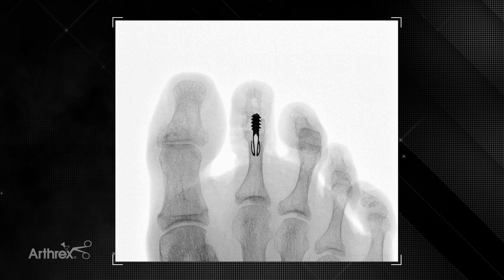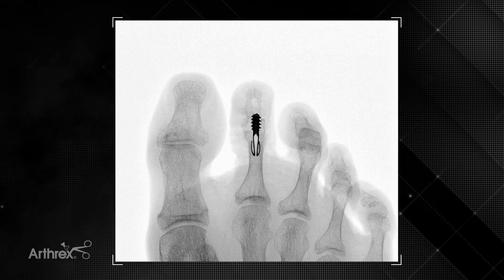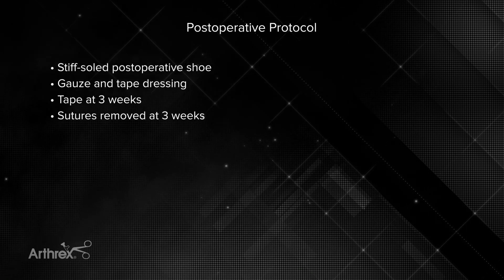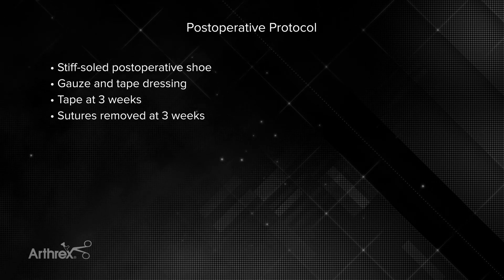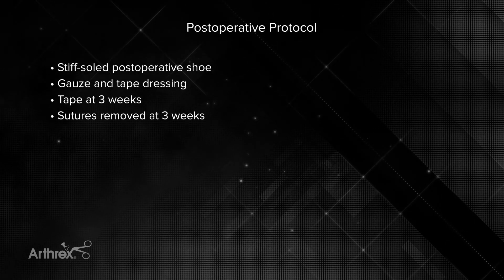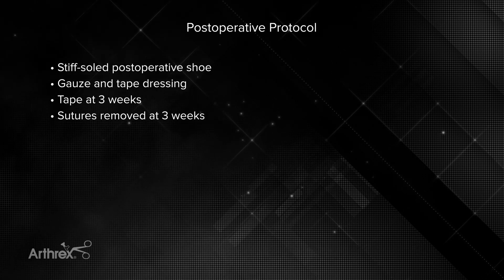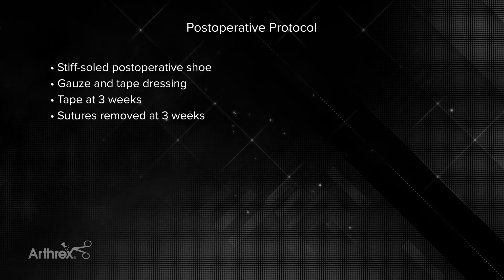Here we see an example of the implant without a K-wire in place, and you can see the implant is well seated. For postoperative care, I use a stiff-soled postoperative shoe and a gauze-and-tape dressing. After about three weeks I'll use tape to hold the toe in position, and sutures are typically removed at three weeks following surgery.